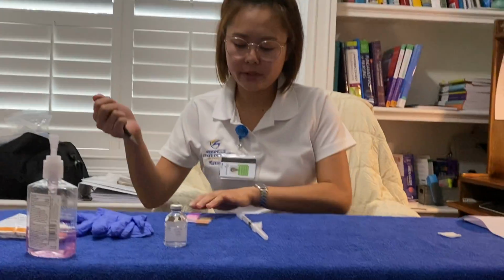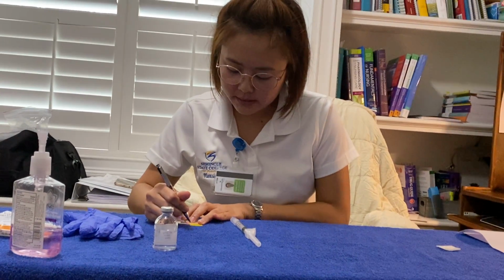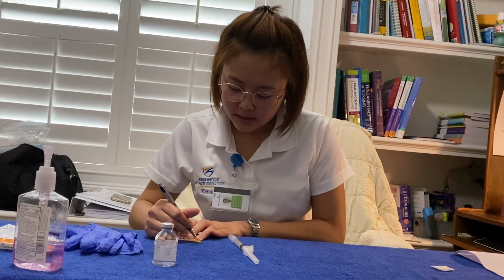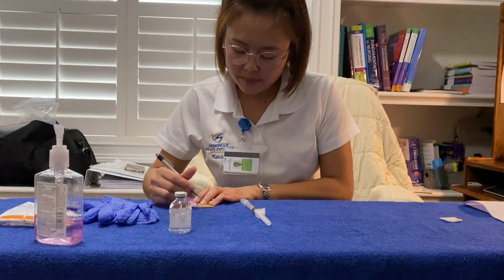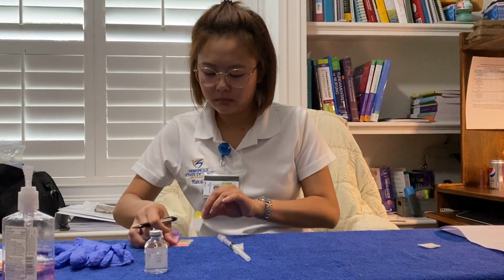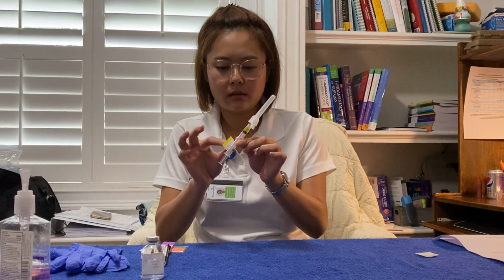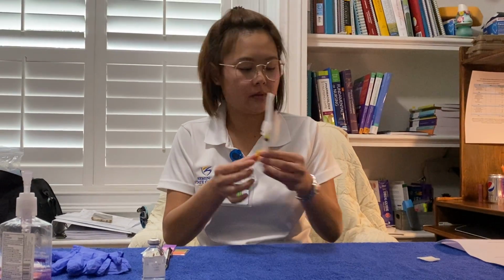Okay, recap. This is a single dose vial, so I can throw it in the biohazard. And then label my syringe: Anna Pulaski, influenza, IM, 0.5 ml, 6:15, time, and my initials. This one's done.